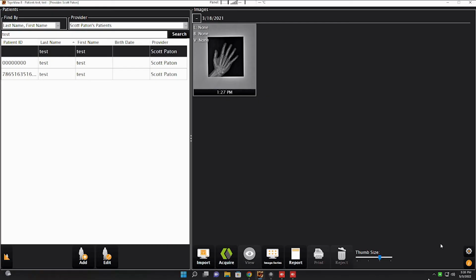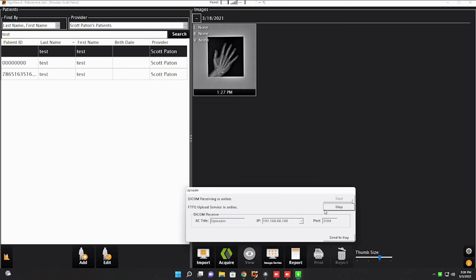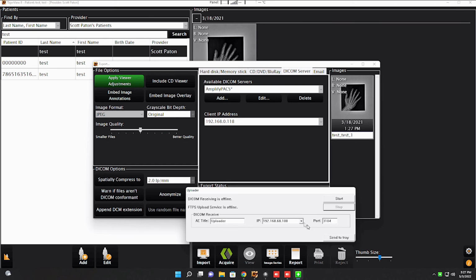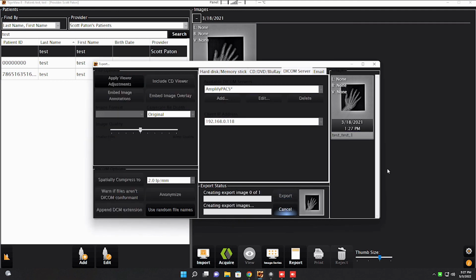Alright, I've restarted the computer, and here let's check again. We're going to make sure the IP address matches. So we have 118 here, and we're going to select 118 in Uploader. So just make sure that the IP addresses all match, and then you're going to click Start, and then Send to Tray, and now when you export the images it should work correctly.